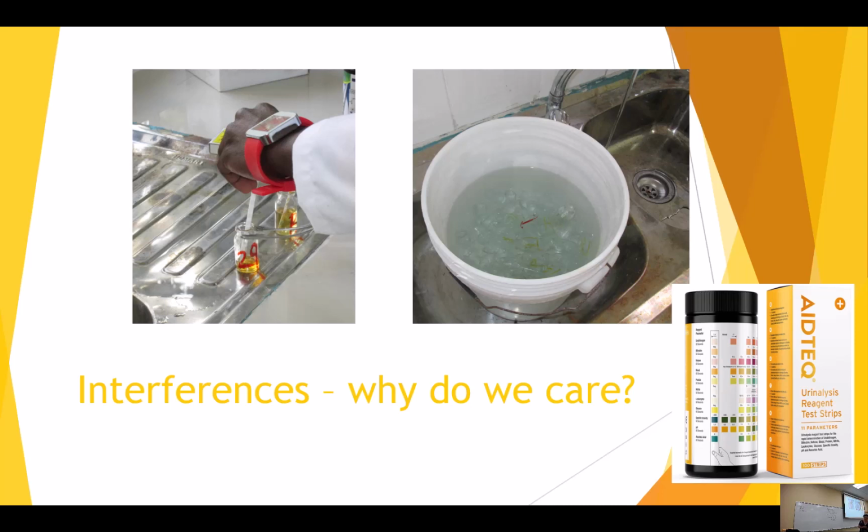So in some countries, they still reuse glass and they wash it. So it's really important to make sure. Bleach in particular is a very common cause of false positives on the strips. So it's really important to recognize that.